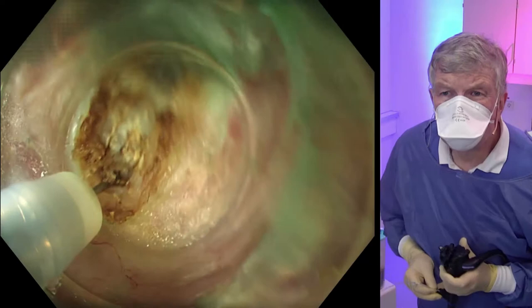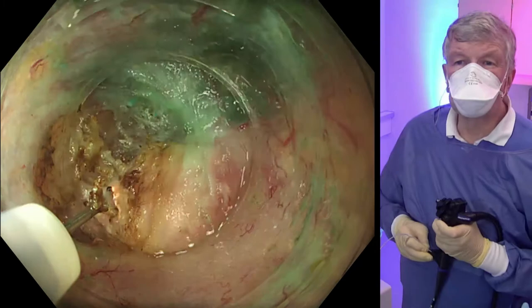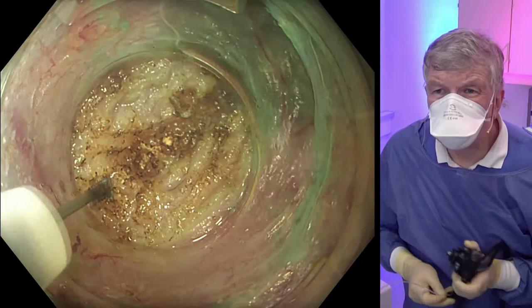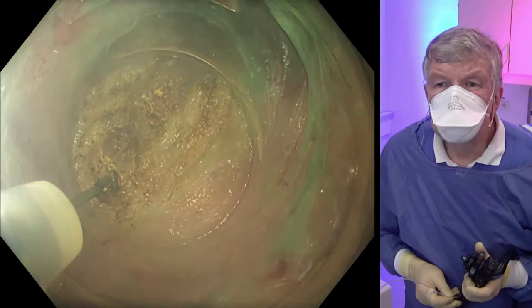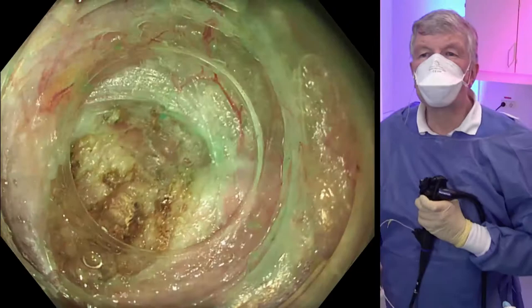The outer longitudinal muscle is there to stay, as we have seen in the schematic drawing. We pull a little bit and continue dissection. Here to the most distal part, very cautiously to save the duodenal submucosal tissue and avoid perforation into the duodenal lumen. The distal extension, or the extension to the proximal site, is less than with esophageal POEM.